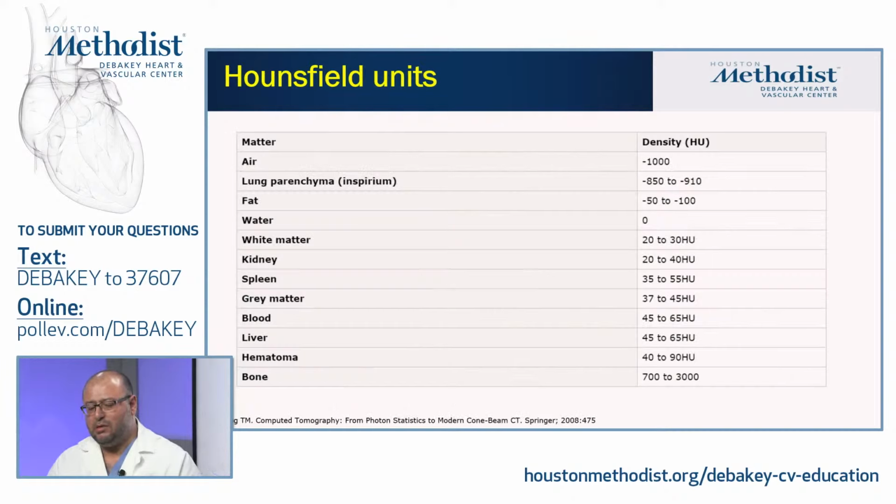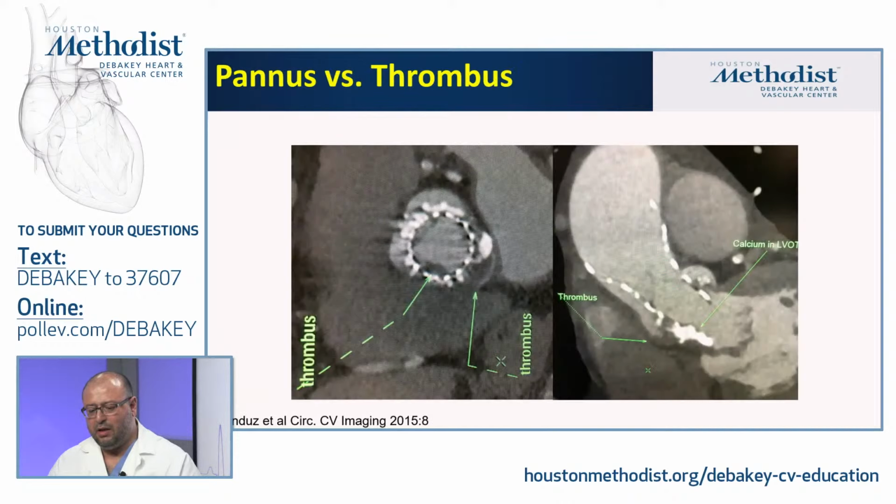CT is always also thought of when we think of prosthetic valves, and in CT we try to look at these structures and come up with what we are looking at. So in CT there's something called the Hounsfield unit, where each matter has its own attenuation compared to water. For example, air is -1000, and we try to look at these structures on these prosthetic valves and determine whether this is blood clot or something else.